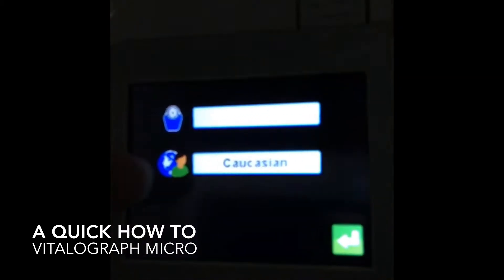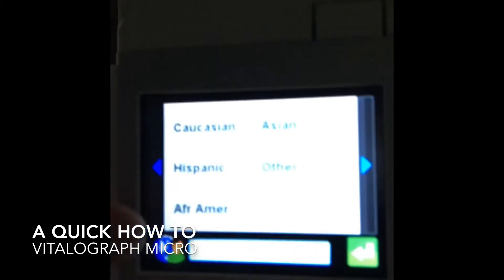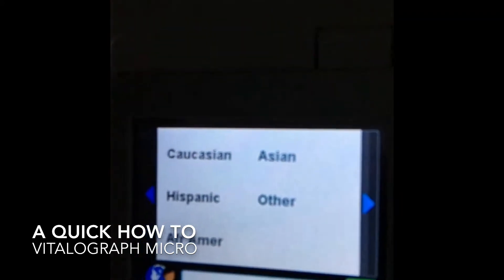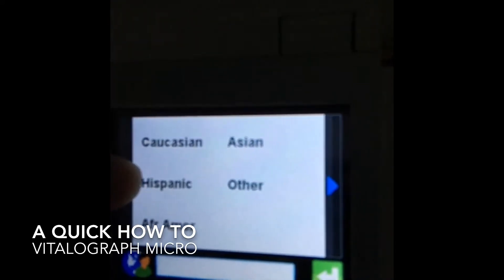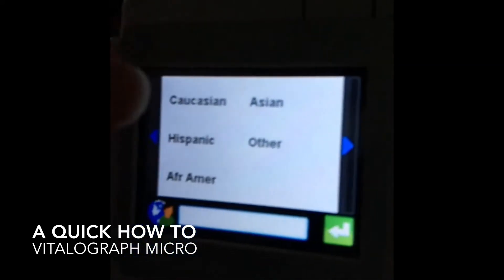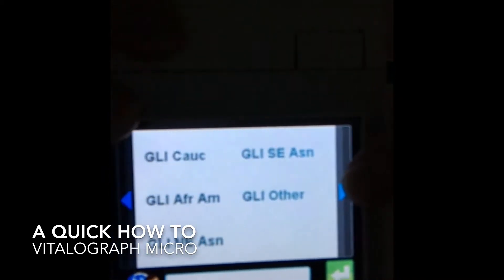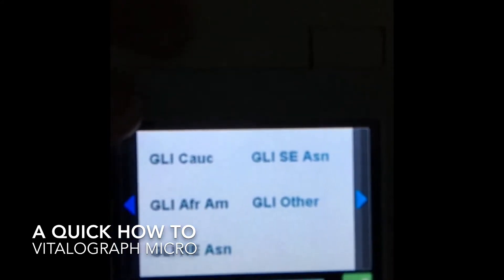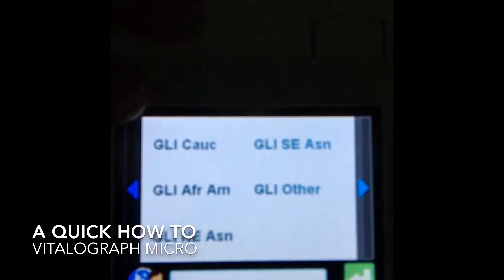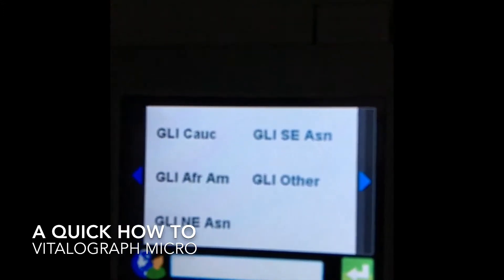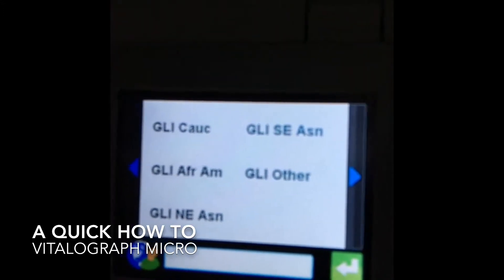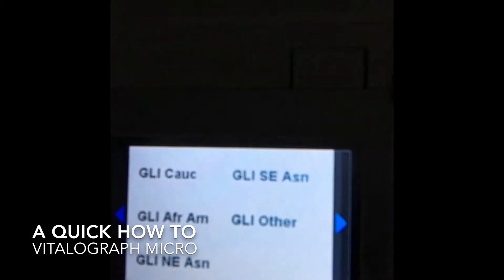Now, to choose your regression set, you can simply tap on this button here. If you select anything in this category, you're going to be utilizing the NHANES regression equation, or we can click over on the other side here, and this is where you select the GLI equation. This is really the most accurate, and it goes down from age 3 up to 95, so I would recommend using the GLI over the NHANES.